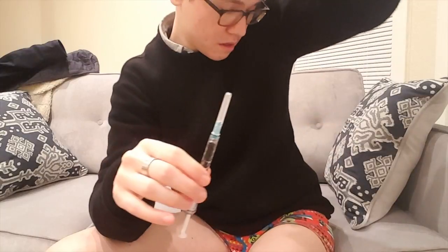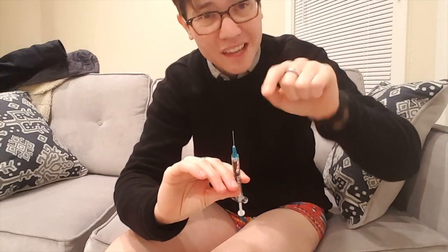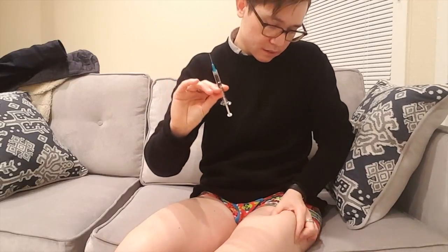I've already cleaned this off. So the next thing I'm going to do is prepare this. I'm going to take this off. I'm going to put my leg out to flex the muscle and then relax it, grab a little chunk of it and then do my little jab. So I'm going to put this down for a second. The needle has an opening, like this. The opening is going to go away from me, so towards you. So I'm going to put my muscle out, relax it, sit back on the couch a little bit further, grab the muscle.